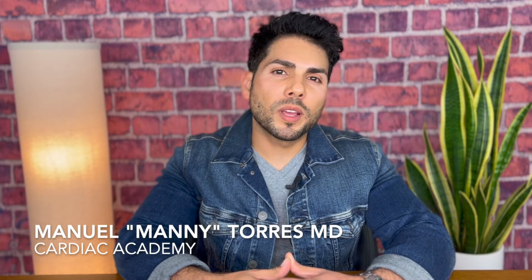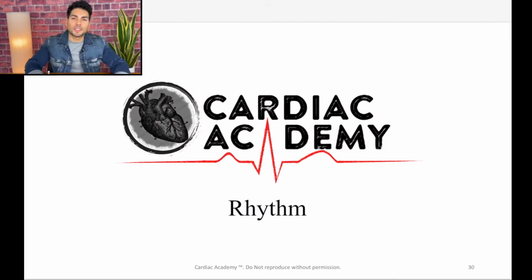In the previous one, we talked about how to interpret EKGs in a systematic way following our very own mnemonic and how to calculate heart rate. So today, it's all about rhythm and arrhythmia. So without further delay, let's get into it. Okay, my friends, let's talk about rhythm.